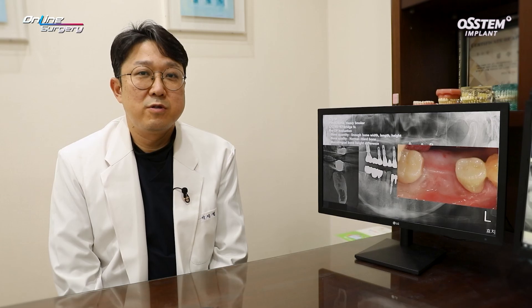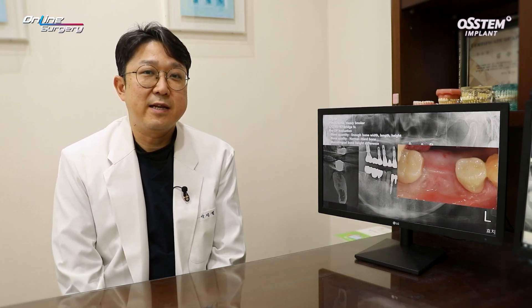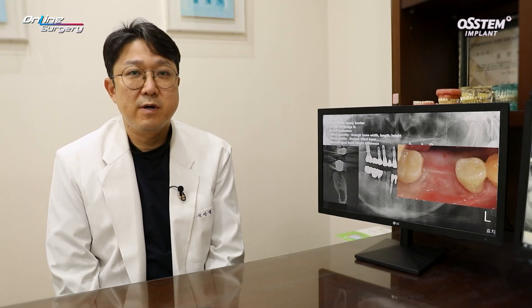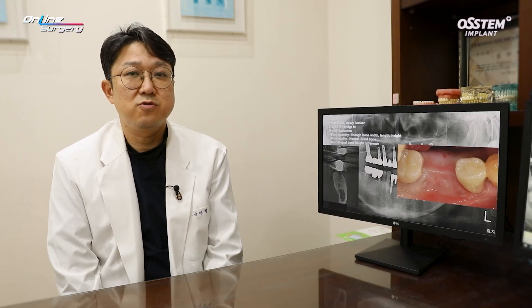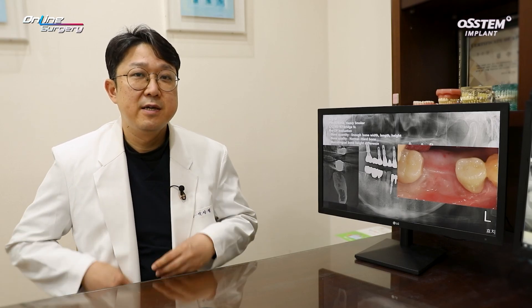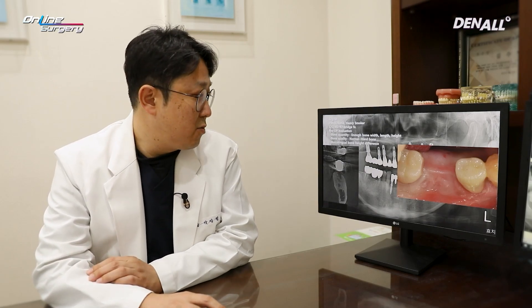Greetings, I'm Dr. Park Jong-chol with the Hyo Dental Clinic. Today I'm going to talk about a very simple clinical case at number 46. A single implant surgery will be conducted.